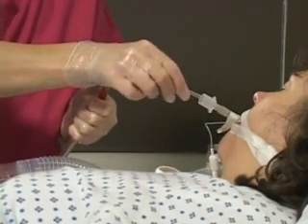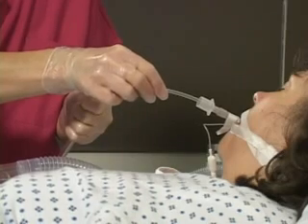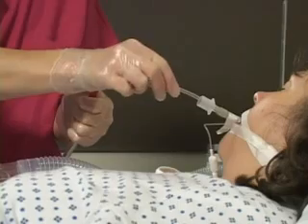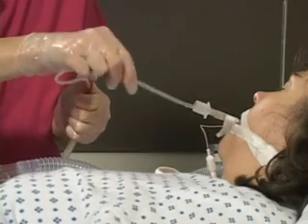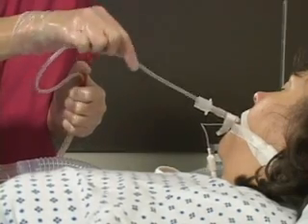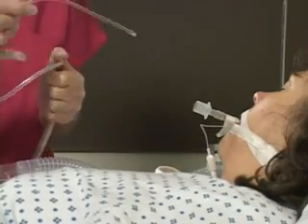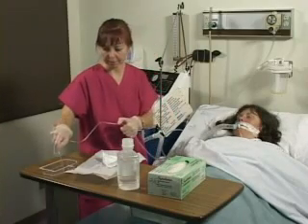Withdraw the catheter 1 to 2 centimeters to avoid suctioning tissue and apply intermittent suction while rotating and removing the catheter. This aspiration should not exceed 10 to 15 seconds, but should be slow enough to allow for mucus to be grabbed by the suction tip. If repeat suctioning is required, then repeat the pre-oxygenate steps as before. A second person will be required to do this manually so as not to break sterility. Rinse the catheter by dipping into sterile water between suction passes.